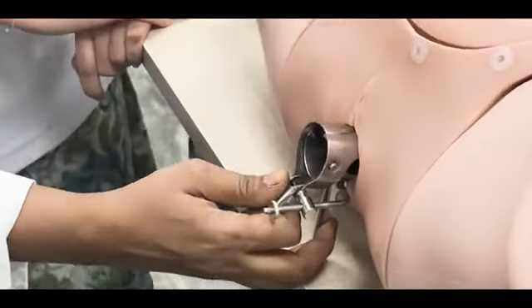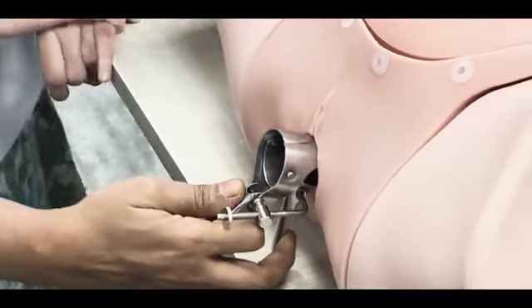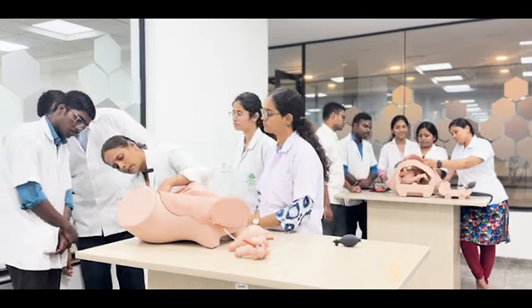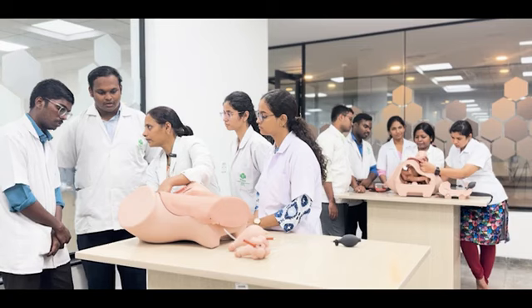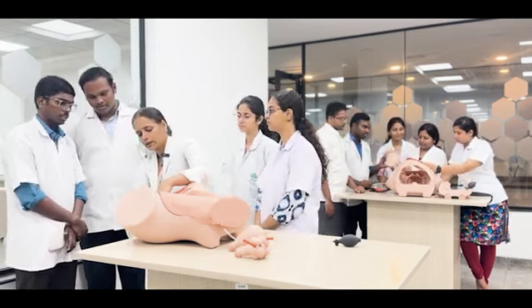So the structure you are visualizing is the cervix, and you are able to see the entire vagina also. There are rugae present in the vagina. Are you able to see? So you have to examine both the cervix and the vagina.